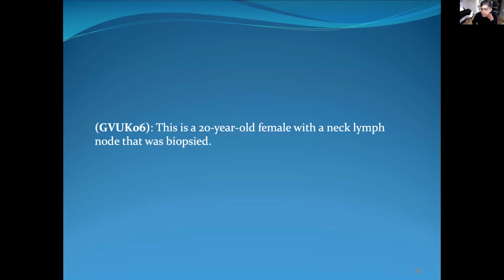A 20-year-old female with a biopsied neck lymph node. Okay, so low power is important. We all like to see low power. There is no semblance of normal architecture. There is a funny mottled appearance, right? Yeah, there's some vague nodularity perhaps, but I don't see anything obvious here.